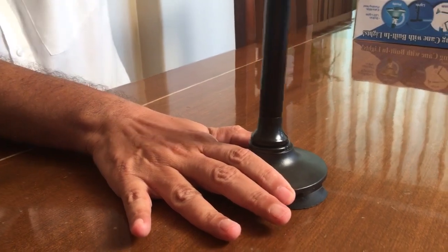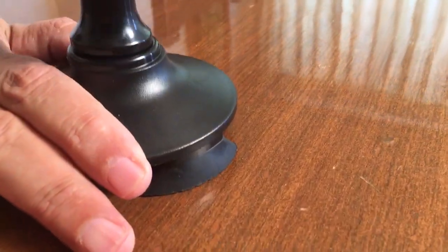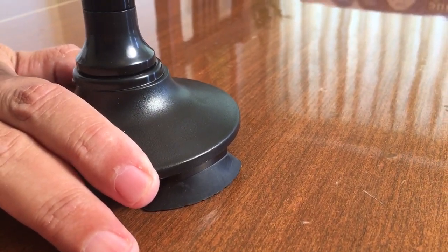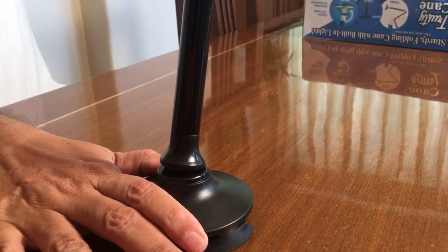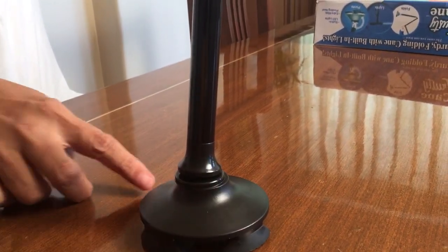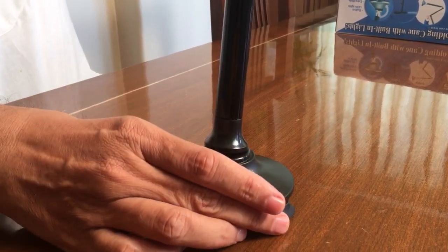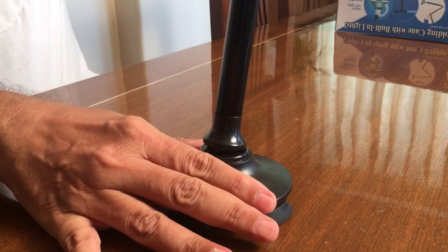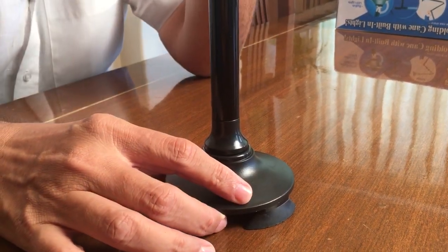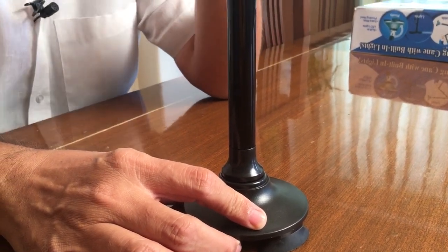There is a cane pivot here. When you are walking, even if your cane is at an angle, the four legs will continue to remain on the ground. Therefore this cane helps in giving a solid grip and solid support to the elderly person.